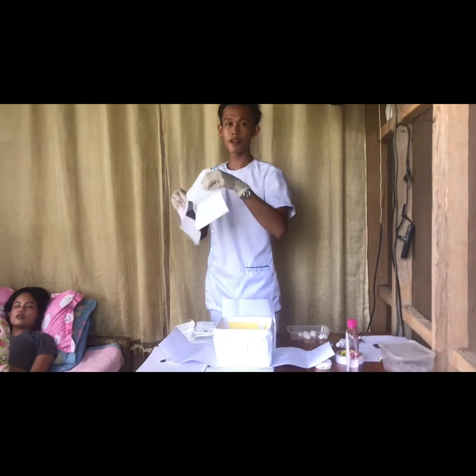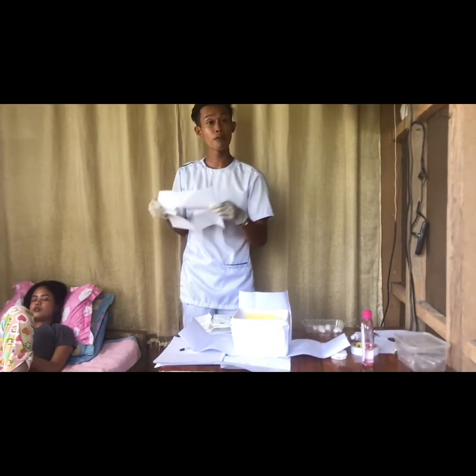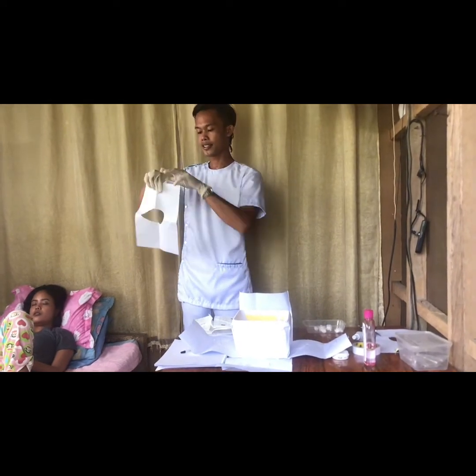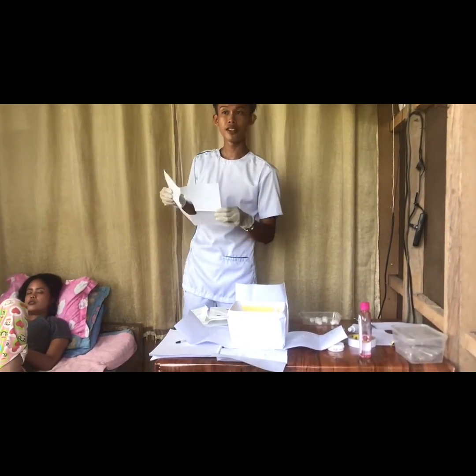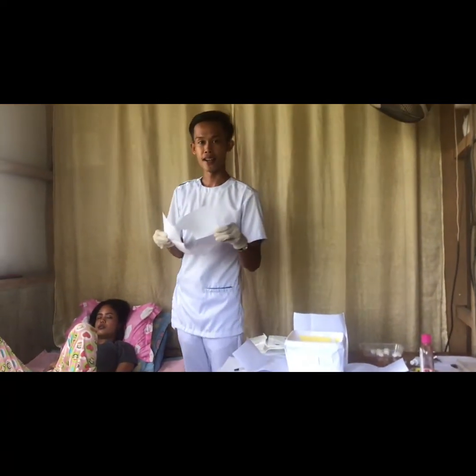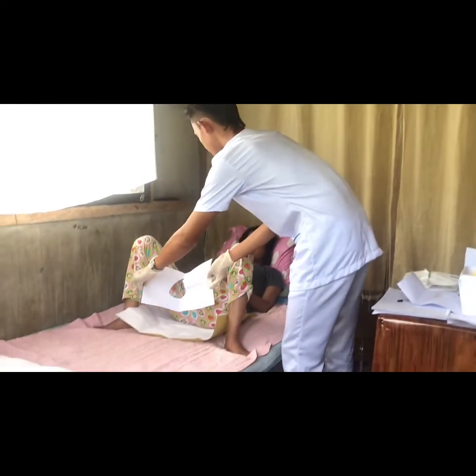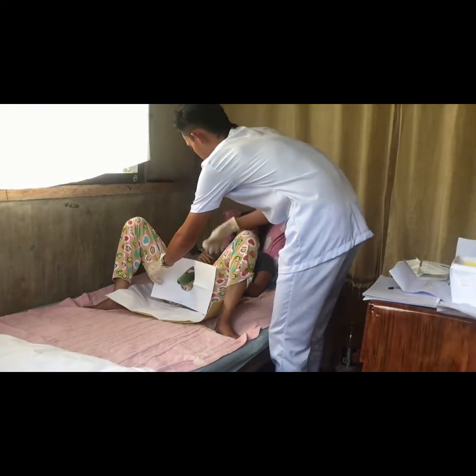The purpose of the fenestrated drape is to provide more privacy to the patient, and at the same time, to widen the sterility of the area. So sir, I'm going to place this. Please hold it.